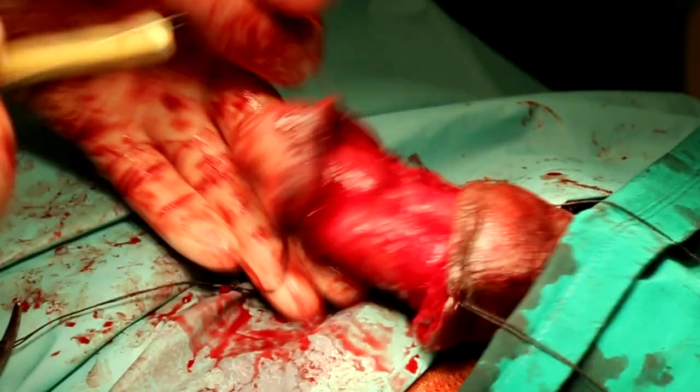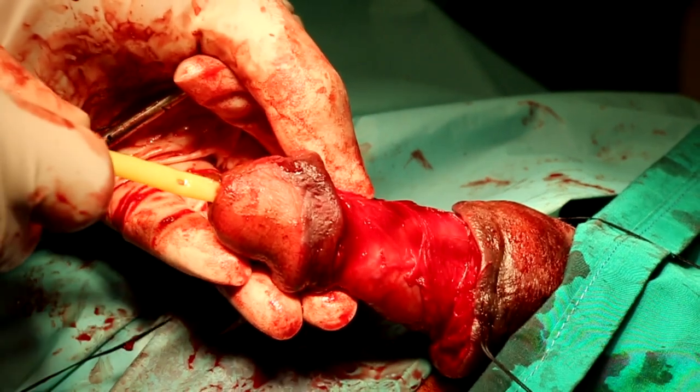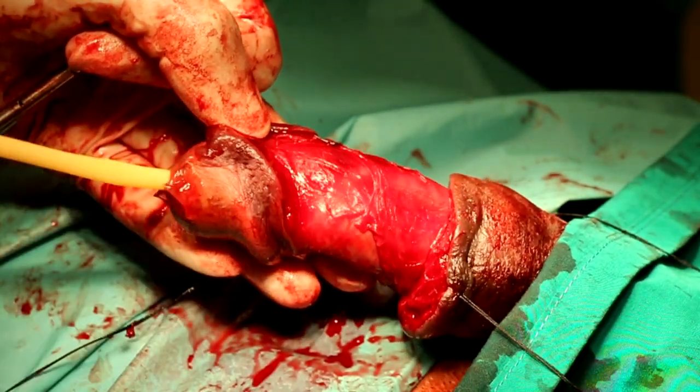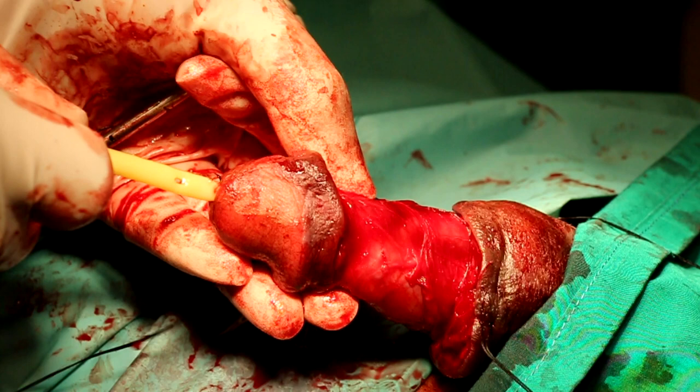Also, this patient didn't have any bleeding from the urethra, but if you want to explore the urethra, it's easy on the table. Just put in a urethral catheter and see if it goes well without any bleeding, which is a good sign. As I said, the incidence of urethral injury is not common, around 9 to 10% in some series. If you find any urethral tear, you have to repair it following surgical principles, with interrupted sutures over the catheter. It's usually a partial tear. It is very rare to have a complete tear or avulsed urethra, but it can be repaired at the same time, and the catheter will stay for 7 to 10 days.